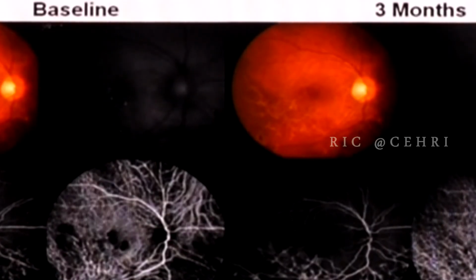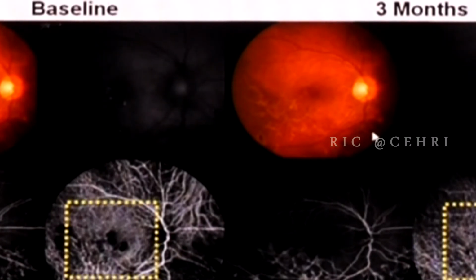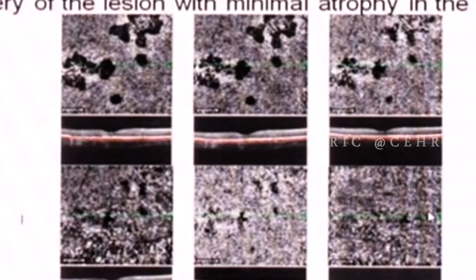I'm going to show you one patient at baseline. Yeah, I'm almost done. This is at 3 months. And you can see these areas totally disappearing, even on ICG as well as on OCT angio. You can see from here to here.